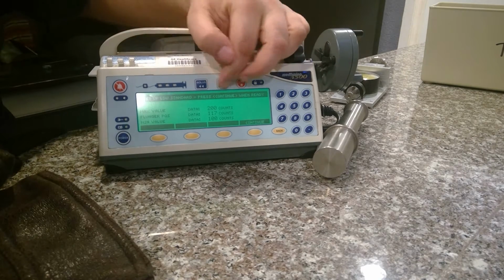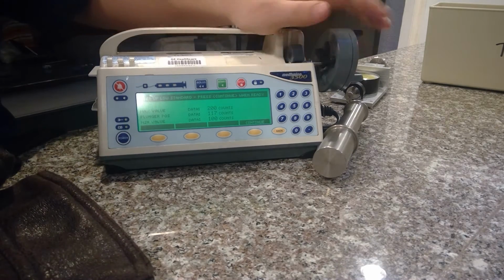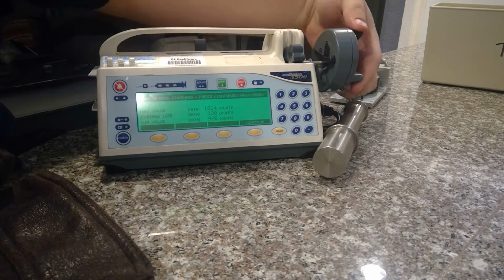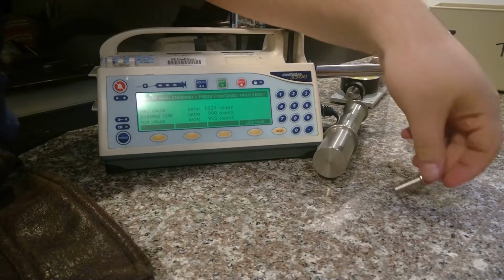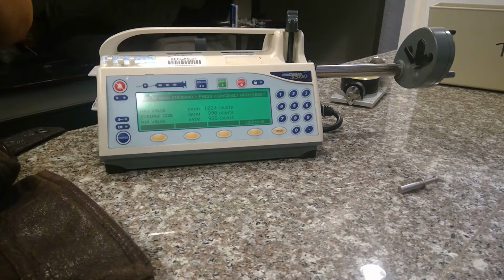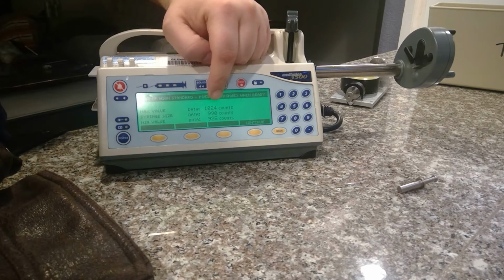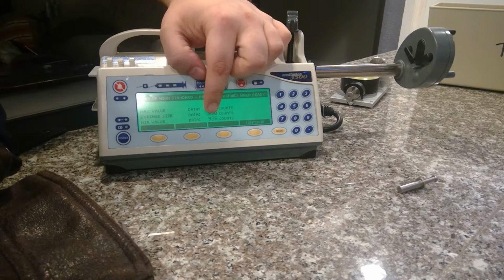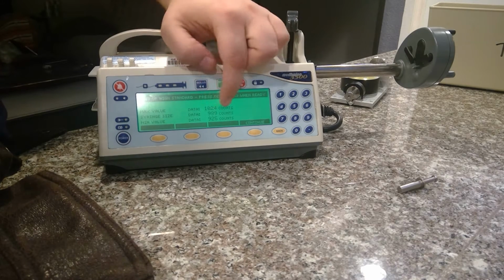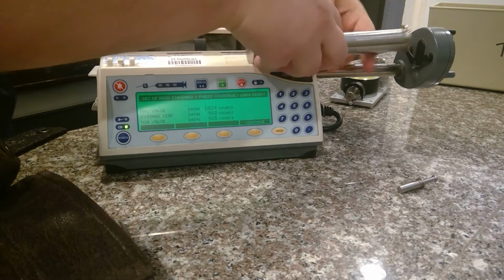This is measuring basically your position. Just wiggle it. Continue. Now it's going to do the high standard. Pull that all the way out. Take this out. It'll tell you in between. So in between, see the data? You've got 1024 counts, and 925 is the minimum value. Usually in between is where you want to hit. In between 925 and 980.